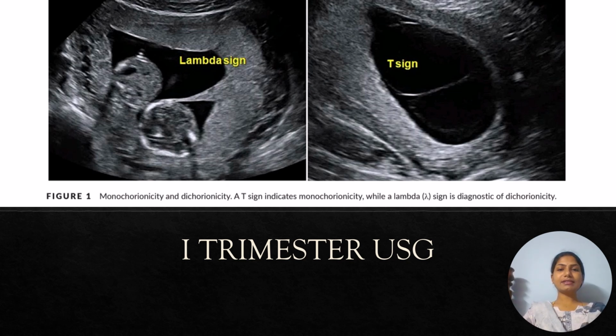If there is CRL discrepancy, there might also be chances of congenital malformations or selective fetal growth restriction in the future throughout the pregnancy. So this risk has to be kept in mind and it has to be mentioned in the ultrasound if it exists. And this is also a very important criterion for us to be more vigilant and do a serial surveillance from 16 weeks to rule out any vascular complications.